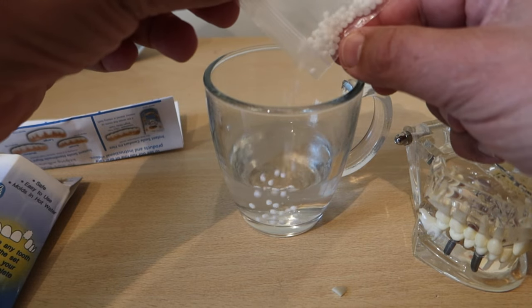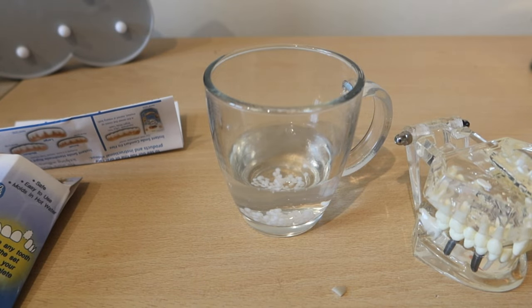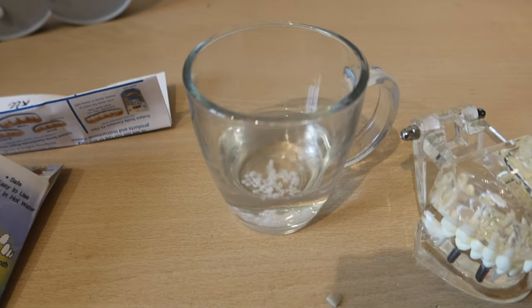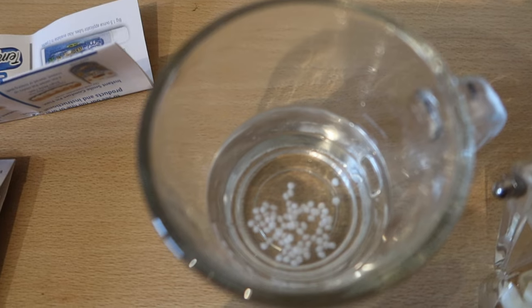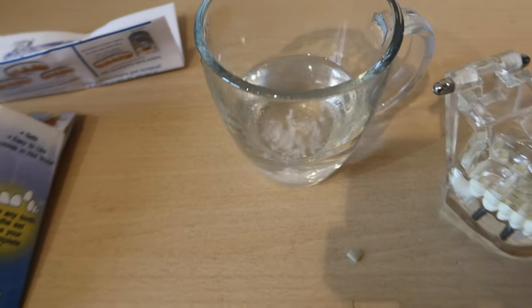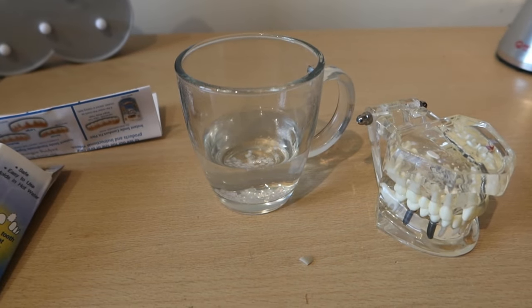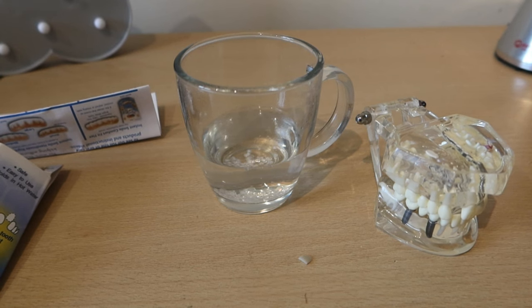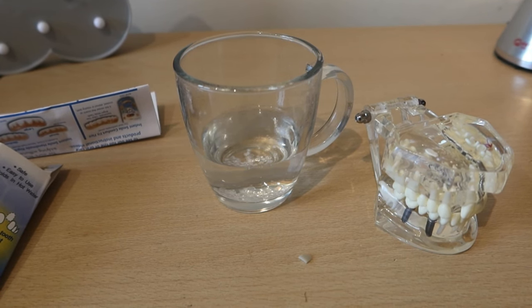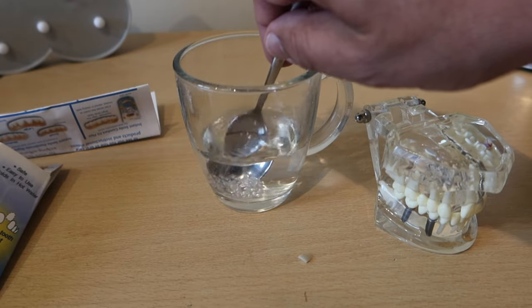There we go. This will now take a minute or so, and what you will find is that the beads change colour from white to clear, and when they're clear they're ready to be used. I'm just going to use a teaspoon to fish those out of the hot water — we're not going to need them all. You can see the colour of the beads has changed.